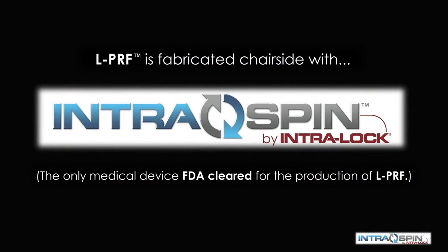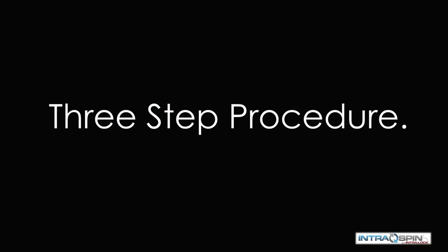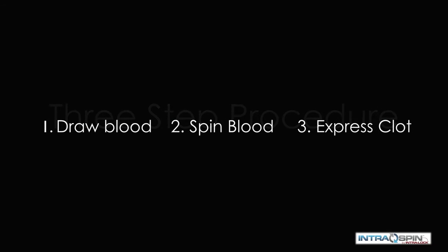PRF is fabricated chairside with the IntraSpin system by Intraloc International, the only medical device that is FDA cleared for the production of PRF. It is a simple three-step procedure: we draw blood, we spin the blood, and then we express the fibrin clots.